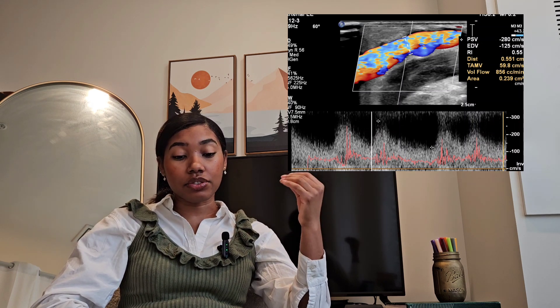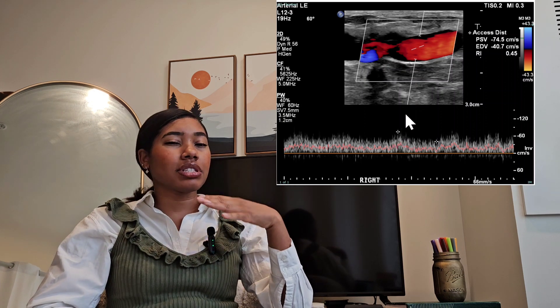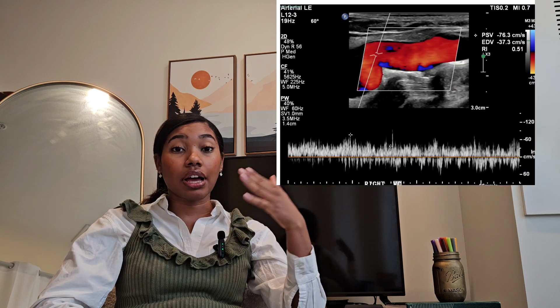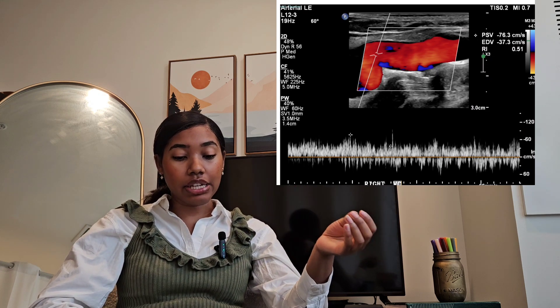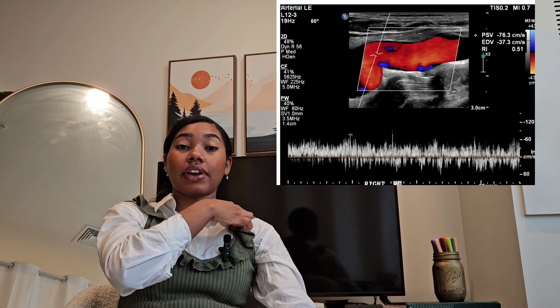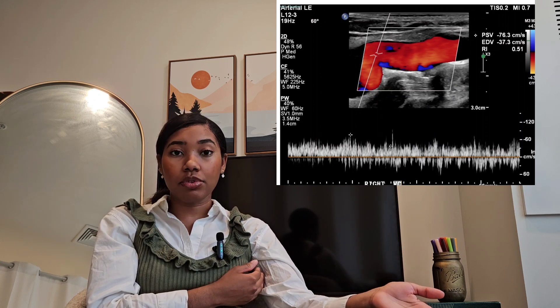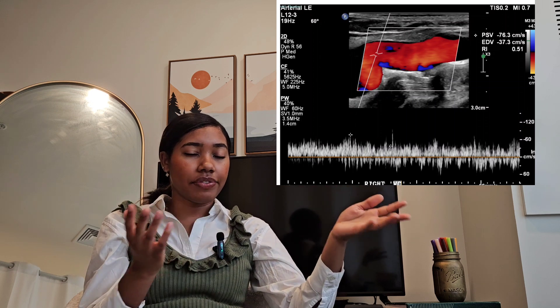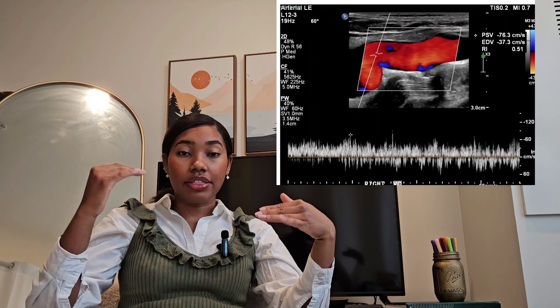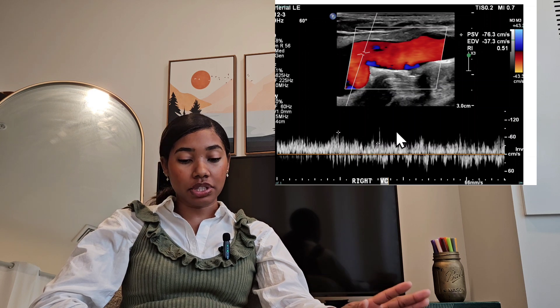Then check the velocity of the distal fistula — here the velocities have decreased significantly to 75 centimeters per second. You don't typically pay attention to velocities themselves unless there's a significant velocity change. Next, check the venous confluence, annotated as VC. For a brachiocephalic fistula, this is where the cephalic vein connects to the subclavian or axillary vein — that's the outflow vein. Check the velocities there; at this point the waveform should be less pulsatile and more venous in nature. As you can see here, it's losing a lot of its pulsatility.